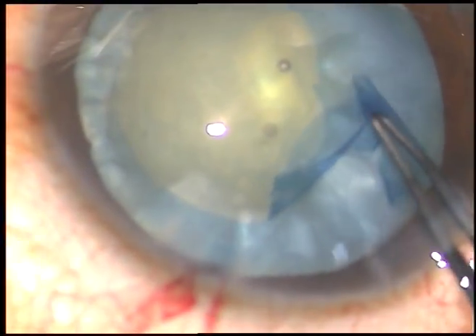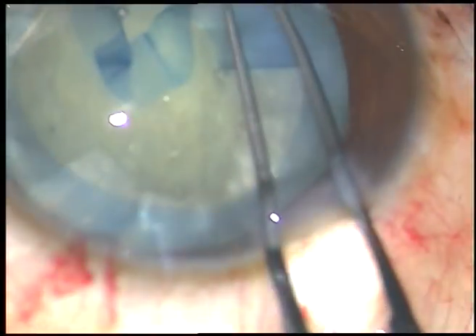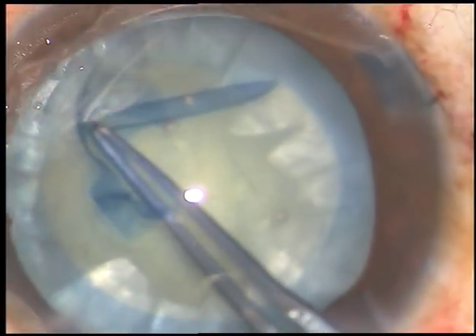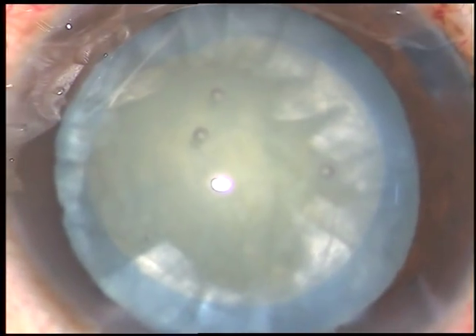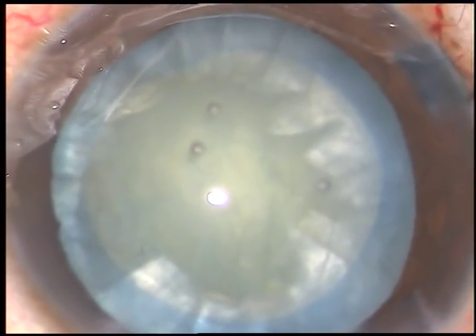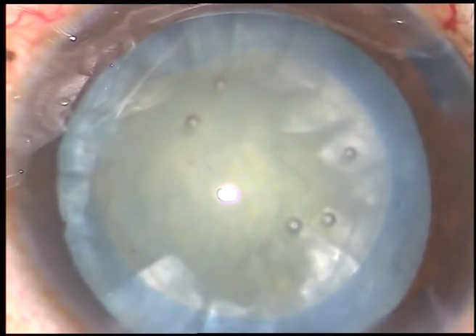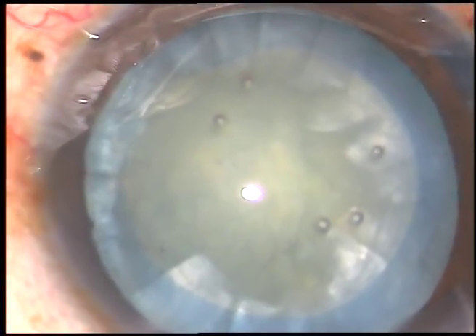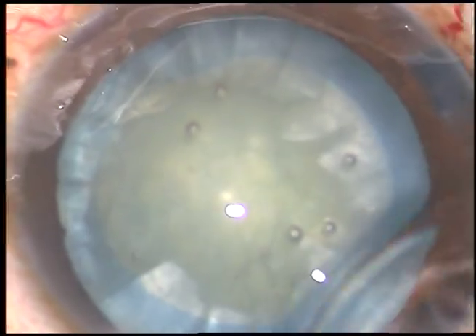I hold this capsular tag with Utrata forceps again and complete an adequate sized rhexis. And if you can do a rhexis like this, you will not need femto or Zepto in cases of intumescent cataracts. That's it. Now, in this case, the nucleus is not very hard — it is grade 2-plus to grade 3 nuclear sclerosis.